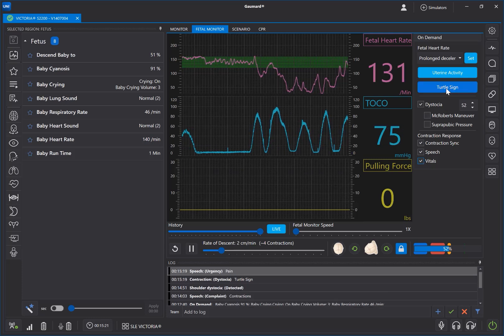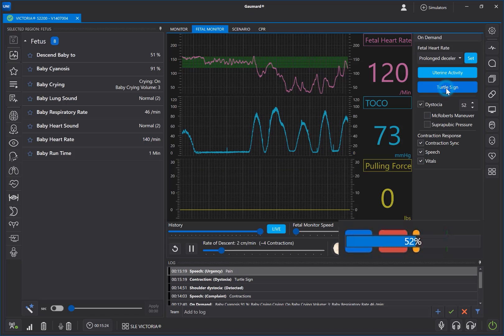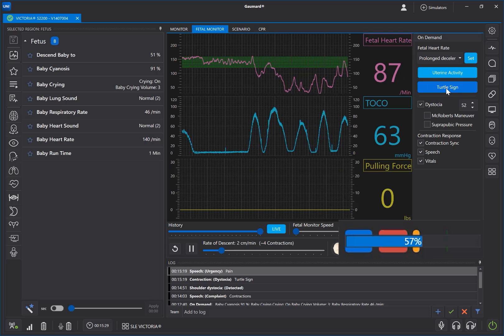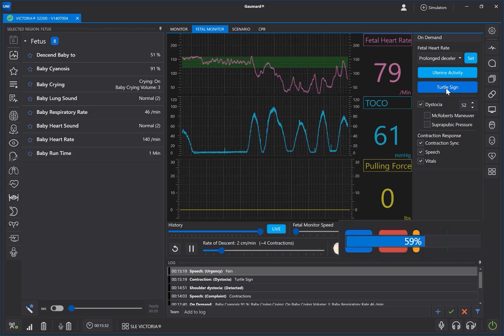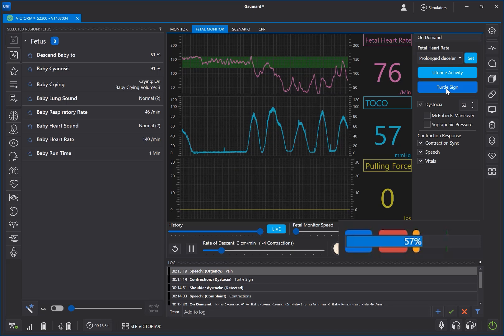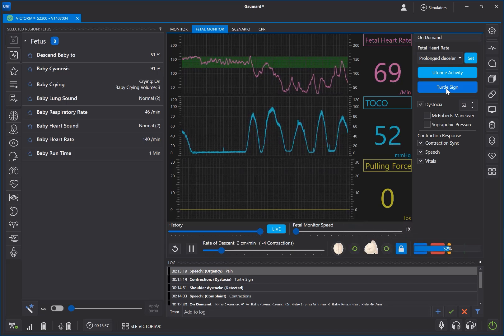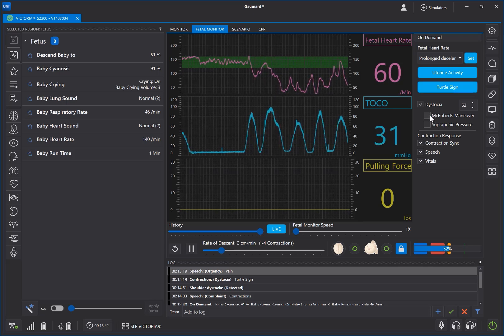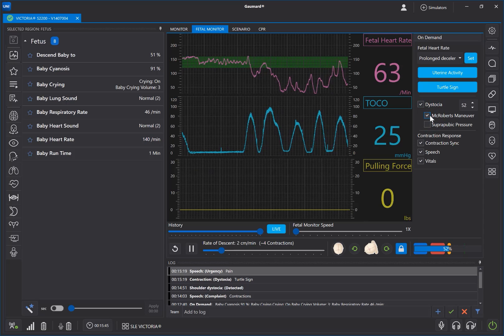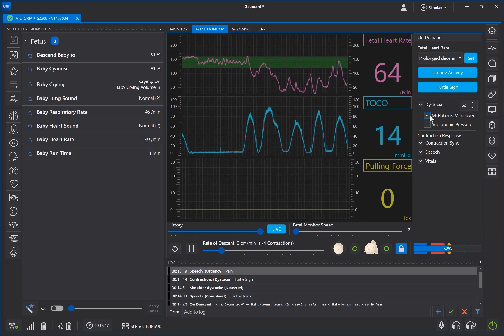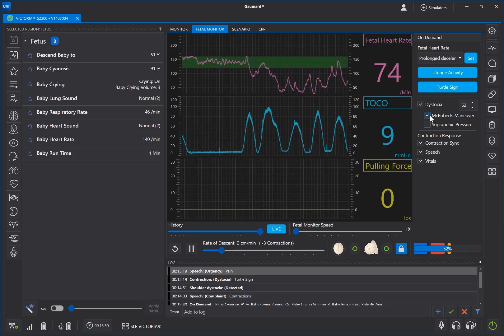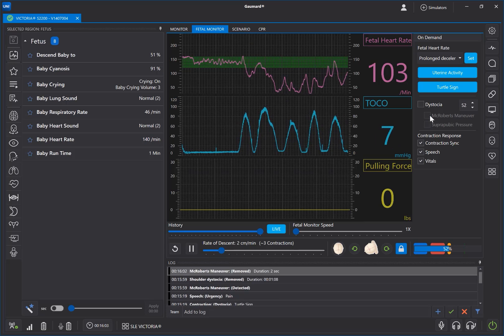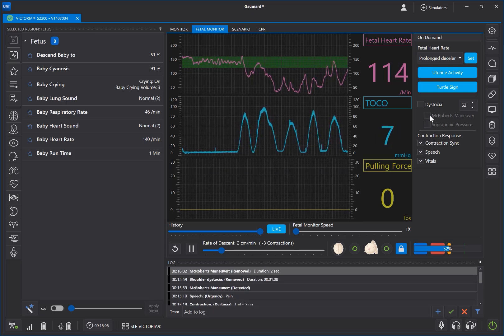While the labor is stopped by a shoulder dystocia, turtle signs will show with every contraction. You can generate additional turtle signs by pressing the Turtle Sign button. If you want an intervention to automatically resolve the dystocia, click one of the boxes below. Clicking both options will not resolve the dystocia until both have been performed successfully.